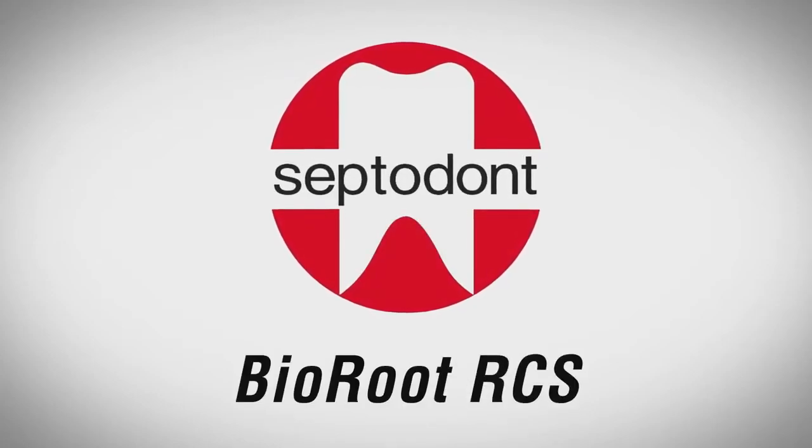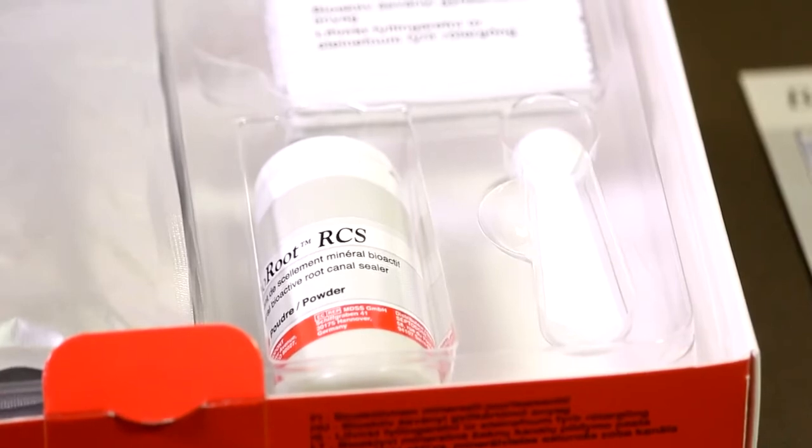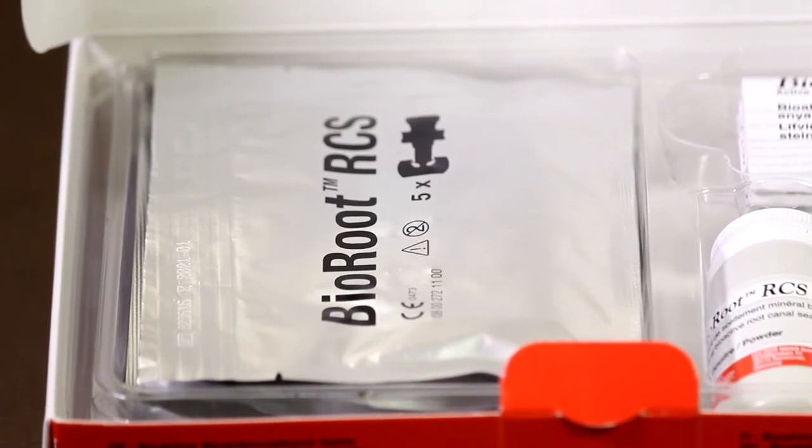Bioroot RCS, brought to you by Septodont. Inside a box of Bioroot RCS, there is a 15g bottle of powder, a measuring spoon and 35 filled pipettes.